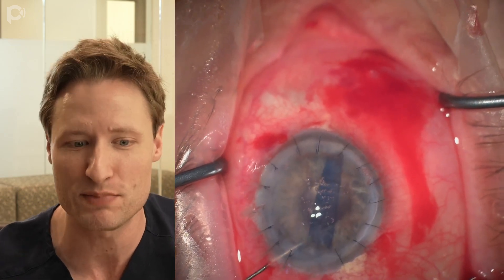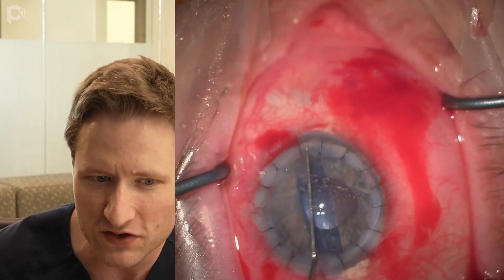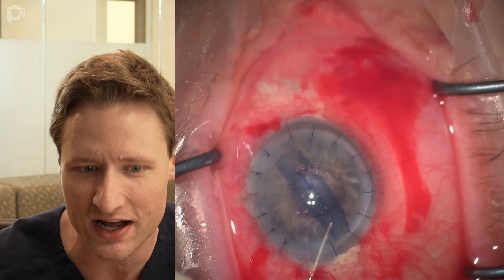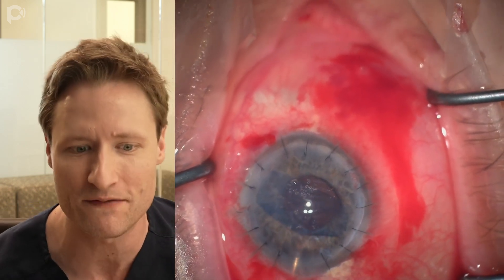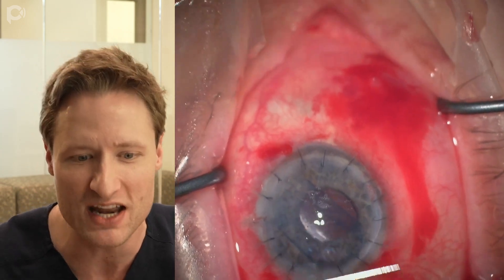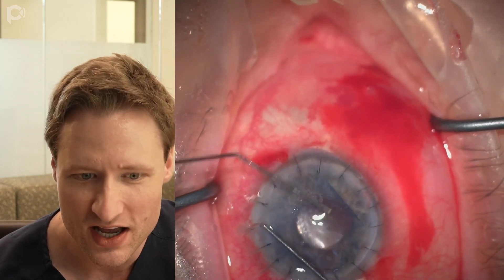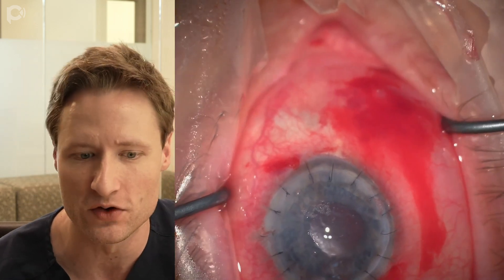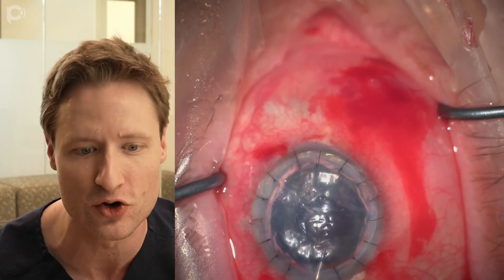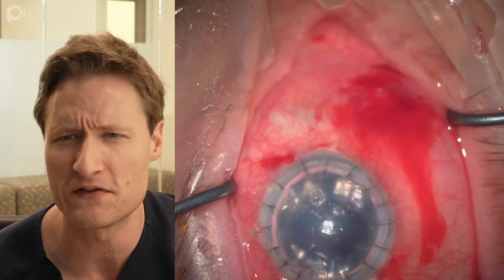When doing DMEK in a post-PK eye, centration can be the most difficult challenge, so that's what I focus on most. The graft appears well centered here. I'm testing to see whether it's right side up — it looks upside down — so I'm flipping it through a paracentesis. Now it's centered in the eye; I'm checking the S-stamp and it's positive, so the graft is right side up. I then burp the main wound to let fluid out of the eye, compressing the anterior chamber and providing the pinning needed to unfold the graft. With just a couple of Descemet's taps on the surface of the cornea the lingering edge unfolds. I'm quick to lift it with an air bubble, because if the graft isn't properly centered it will overlap the recipient rim or interface and you'll get a detachment.